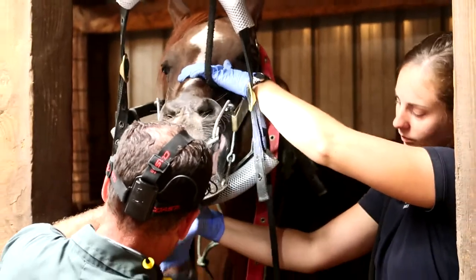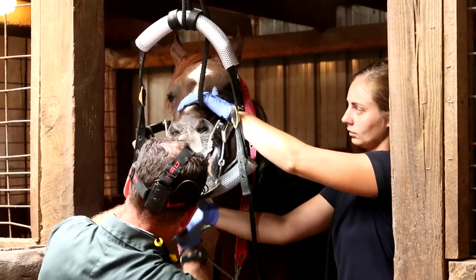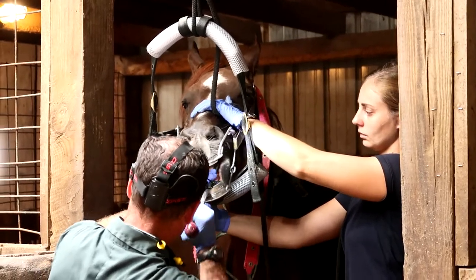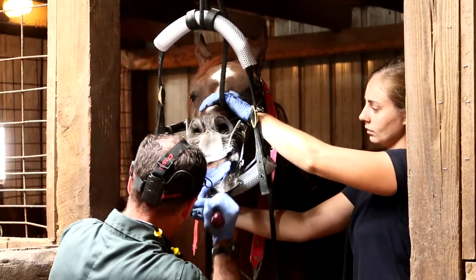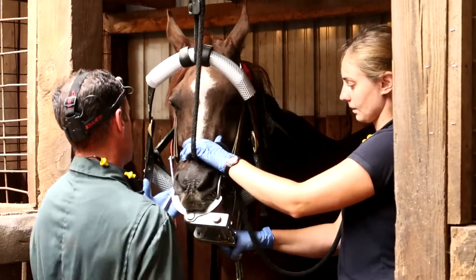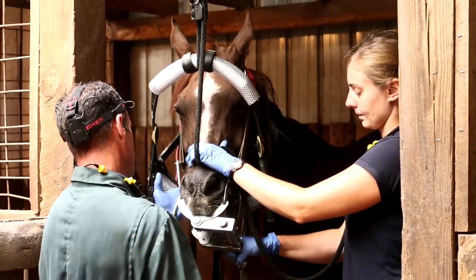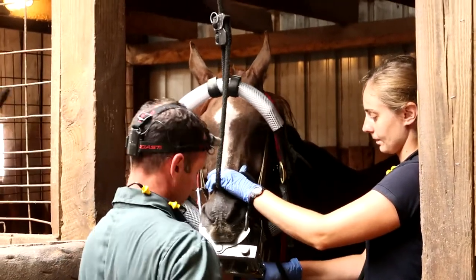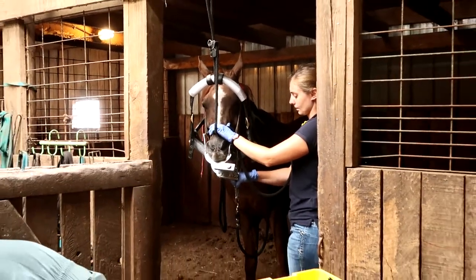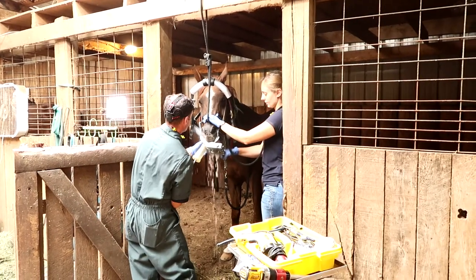The hand tool that you see him using here is the one that you see most vets use to do the entire procedure. Dr. Scott is educated in using the different types of drill bits and he's very meticulous about the way that he works, so I never feel like Tino's not in good hands. He's constantly checking to see if he's missing any sharp points and uses the hand tool to fine-tune and do an overall quick sweep.